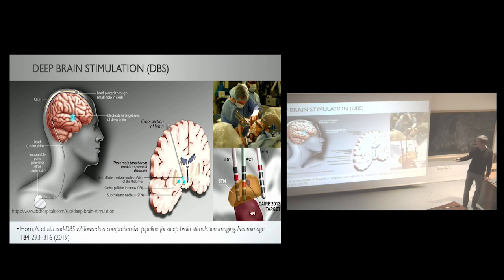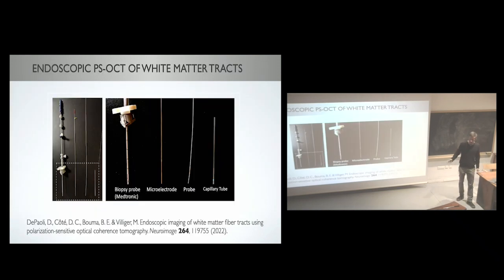And so it consists in implanting this electrode deep into the subthalamic nucleus. This is done stereotactically, so you attach a frame to the skull, do pre-surgical planning, and then bring that probe to the target location within the brain. Obviously, this procedure has certain errors, and the efficacy of this therapy really relies on utmost precision. Again, our OCT probe matches very closely existing stereotactic neurosurgical tools, and we think it should be straightforward to integrate this into the setting.